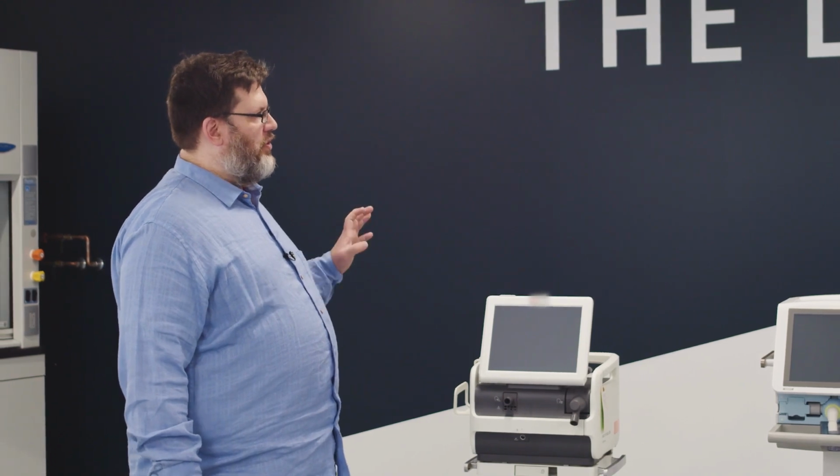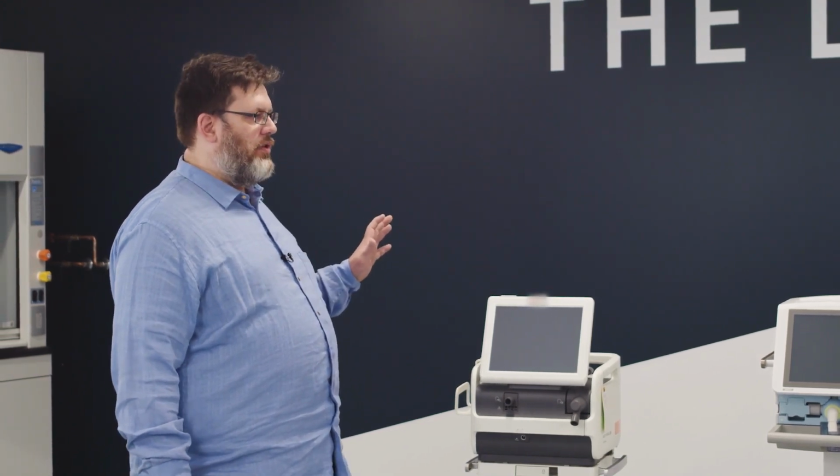They're not fully featured, fully decked out ICU ventilators, but they do have the modes and features necessary to take care of patients in ICUs. And it wouldn't be that unusual to see one next to an ICU bed. So these devices have plenty of advanced ventilation modes and features. The thing that we're looking at is how easy is it to put them in a box in a warehouse and not touch them until you need them?